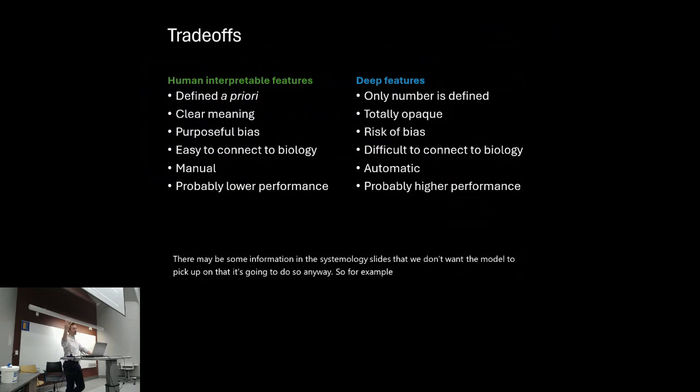So for example, the TCGA aggregates slides from all over the United States. Those slides get scanned on different scanners, and the signature of those scanners may be hidden in these images. And similarly, the histology slides themselves are made at different institutions that have different concentrations of the stains that we use to actually make the slides. Because those institutions serve different patient populations with different racial makeups, you can imagine that a model that picks up on those differences in staining may be biased by race in that way.